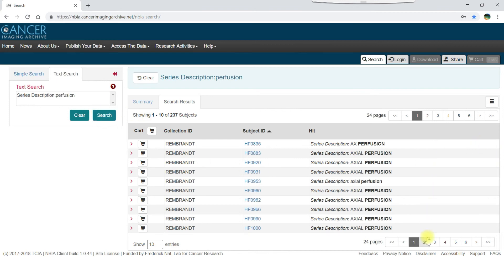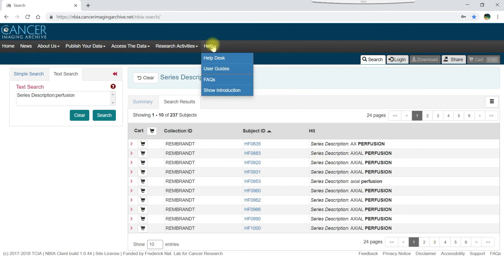If you need more help with the TCIA data portal, refer to the help menu, where you can find links to the help desk contact information, the TCIA data portal user guide and other guides, frequently asked questions, and the introductory tutorial.